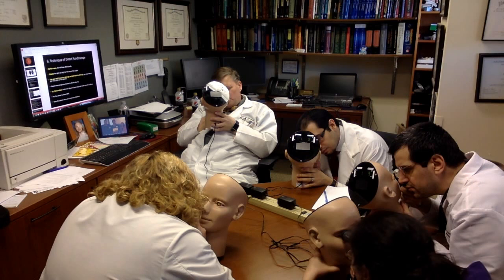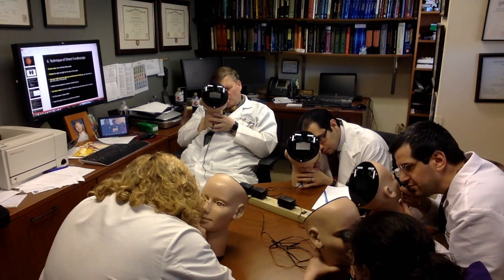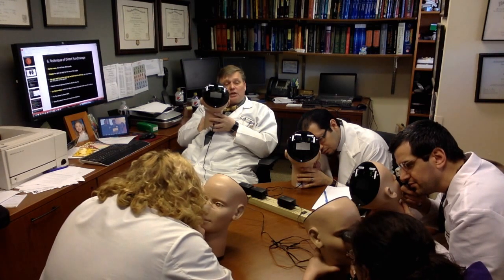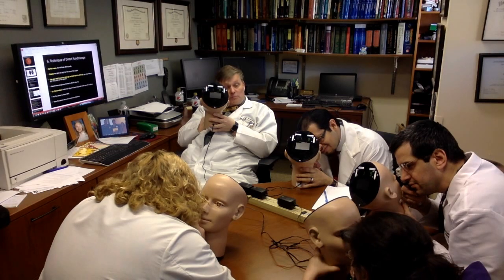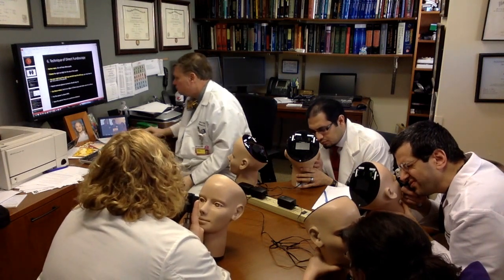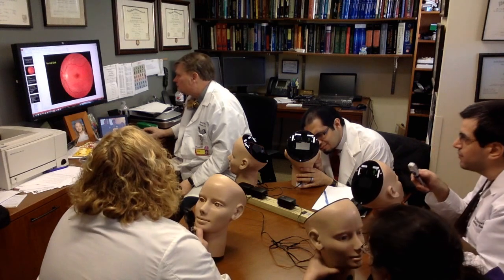In general, when you look at the disc, if the person can cooperate, you look at the disc and the arteries, then scan the retina in all 4 quadrants, and then look at the macula at the end. The easiest way to do it is to say to the patient, look directly at the light. Then they will turn their eyes, and the macula is looking directly at you. Cool. That's the easiest way. Okay, good. Now that's the normal retina.